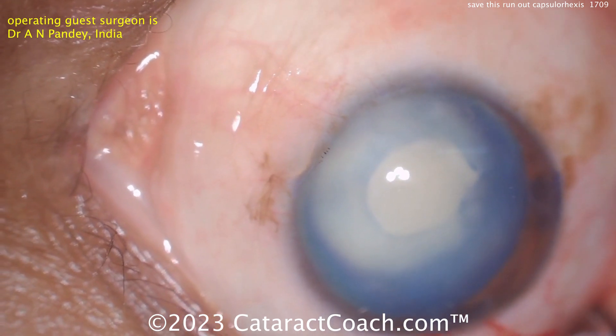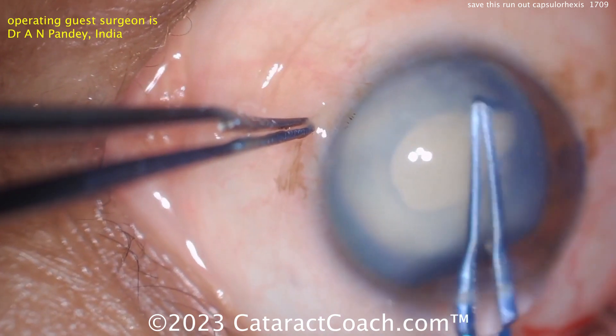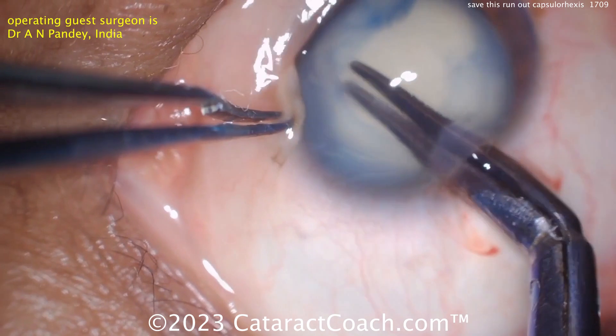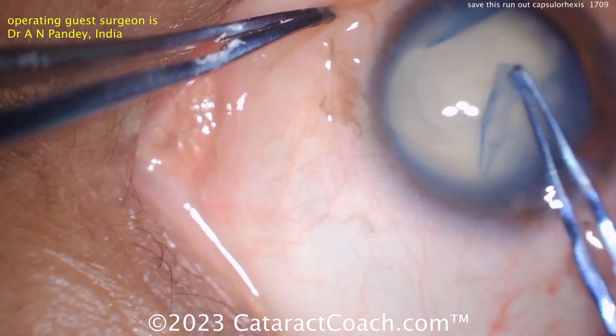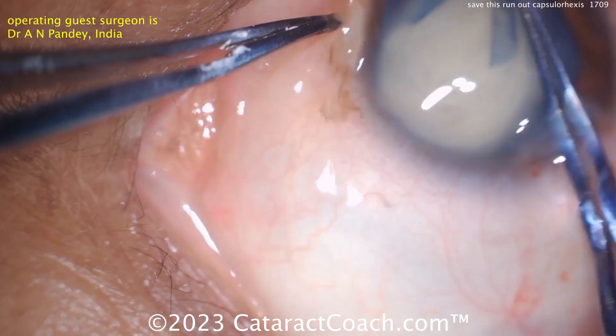Now you can cut it with the scissors and enlarge the capsulorexis. Going in now with more viscoelastic, but be careful — this capsulorexis can run out, and there it does. It's not all the way. The surgeon here is going to go in the opposite direction and make another cut.